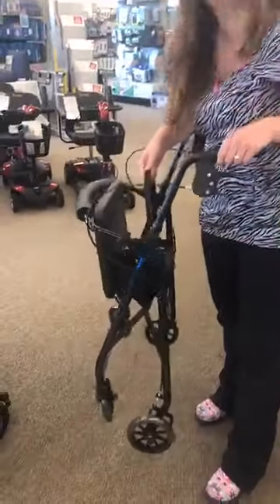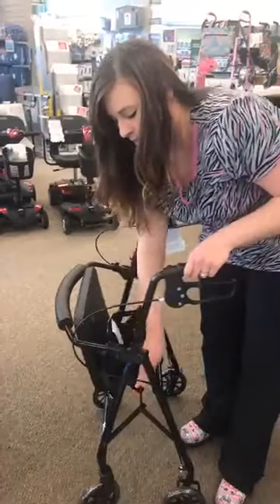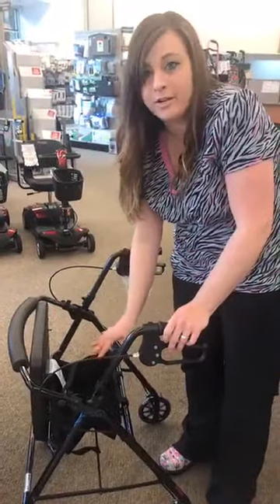So when you've got it folded, when you get it out of your car to unfold it, this bar right here in the center of it, you just push down. Make sure it locks. You'll feel kind of a little lock to it. Make sure it's locked before you actually start using it.